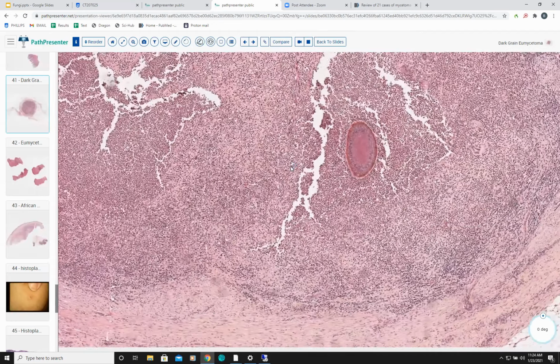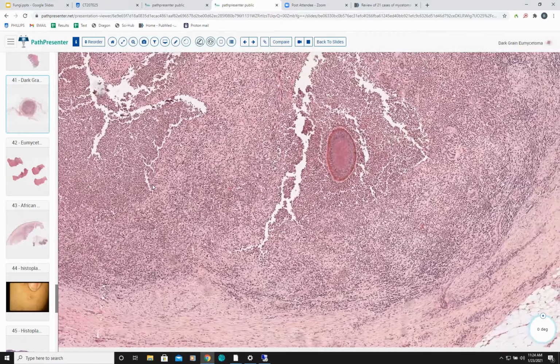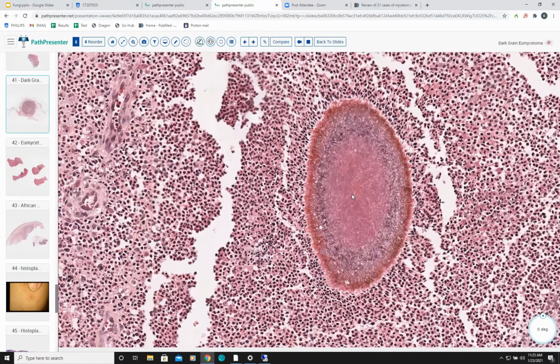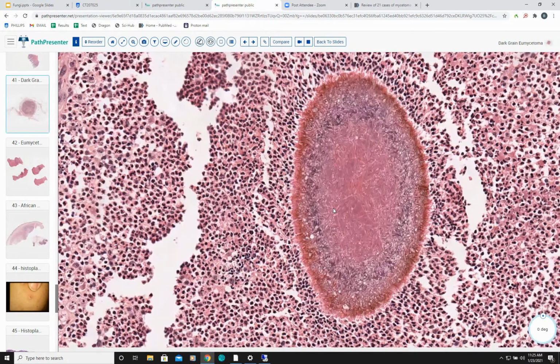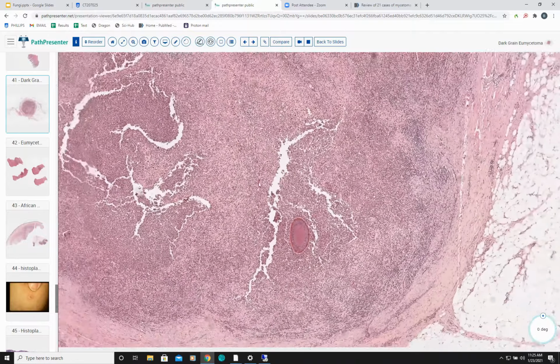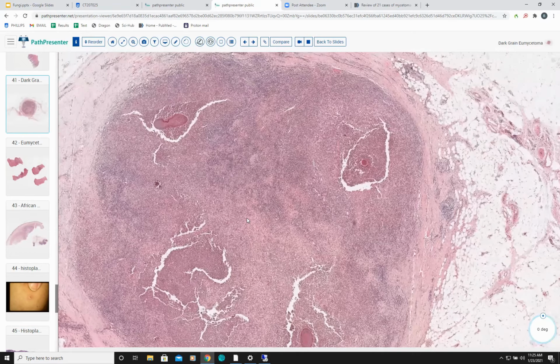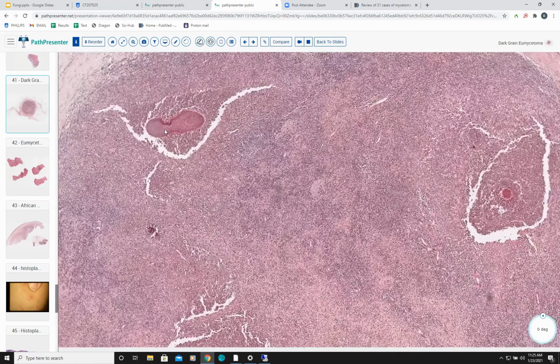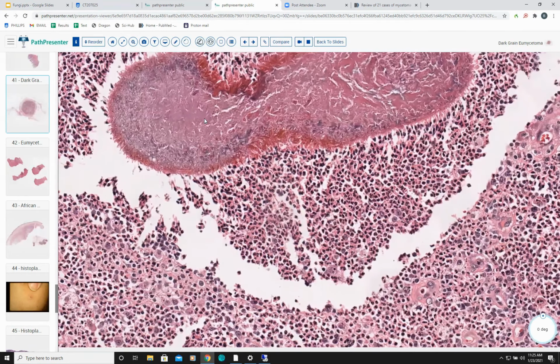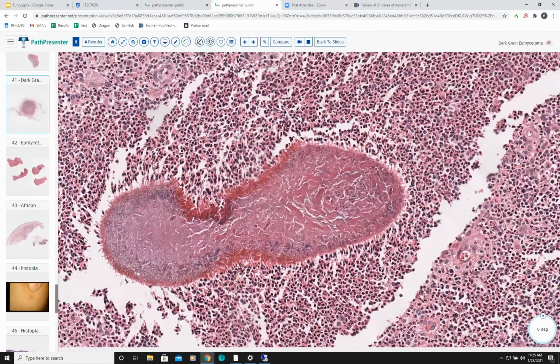So here you have this dense neutrophilic infiltrate with necrosis, and in the center here you find the granules, and when these stain up with a PASD stain, these are fungi. So this is not actinomycosis. So when you see clinically mycetomas, most of them are actinomyces and bacterial, but there are fungal mycetomas, eumycetomas, and these are these fungal organisms in the center. Beautiful case.